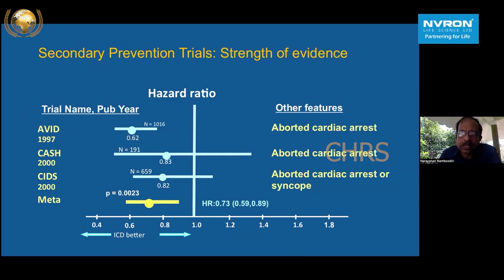Of course, when you put an ICD, we know it is not going to shock every patient. I generally tell the patient, if you get a shock, that is good because you required it and your life was saved. If you don't get a shock, fine. You never required it. That is the best thing. So it's like insurance. If you need it, it's good. If you don't need it, that is much better.